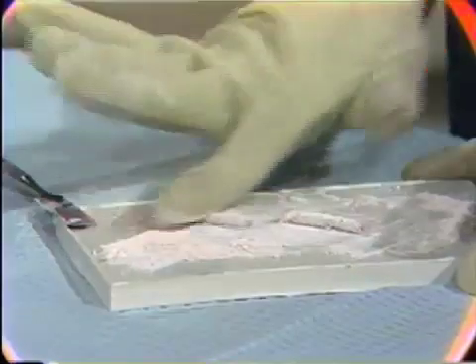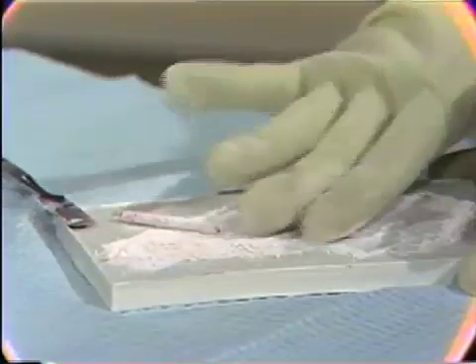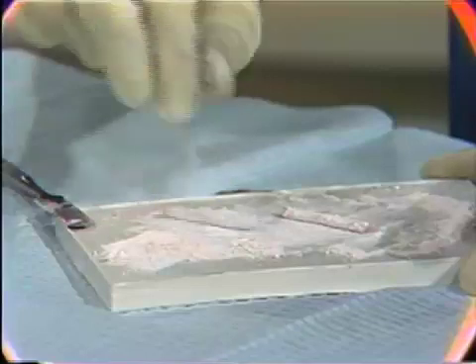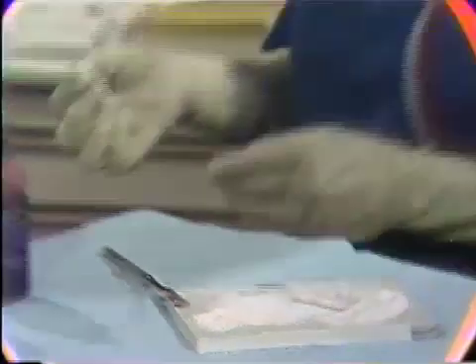Notice she's putting more powder in there, and just before she's ready to bring it off the pad, she'll drop it so the excess powder comes off, and then it will be given for immediate placement in the mouth.